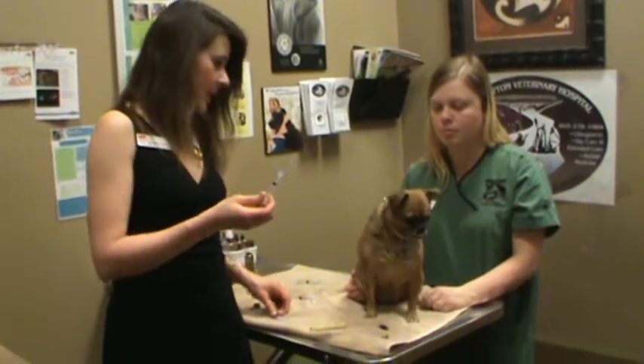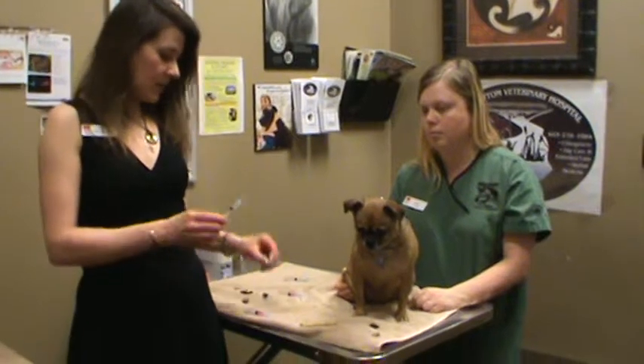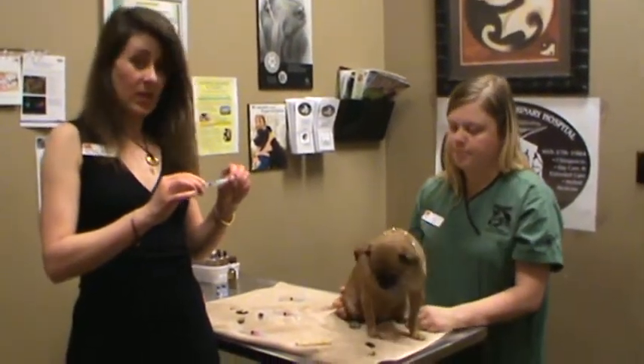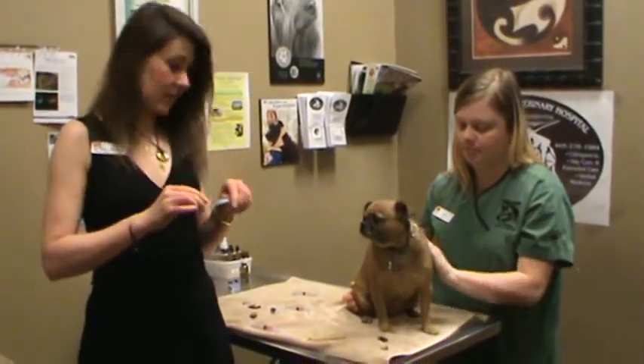Once you have it ready, you want to line up the dog. If you have to pick up your dog, you can gently put the cap back on the syringe — it's just important not to touch your hand or finger to the needle. If you do, you have to replace the needle with a fresh one.